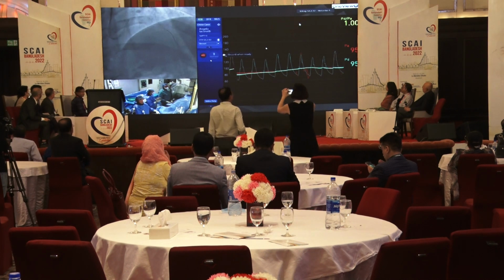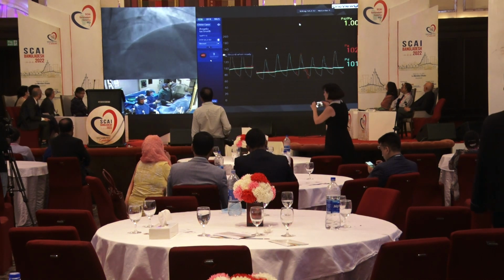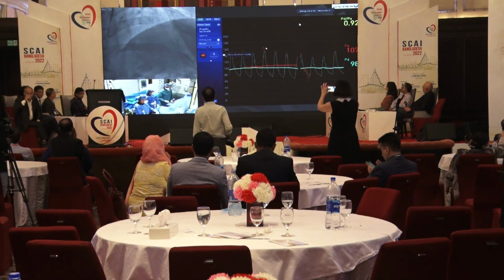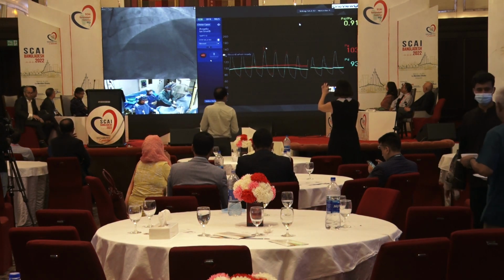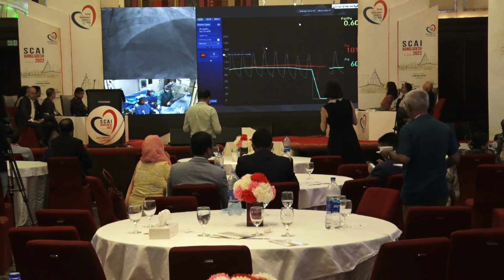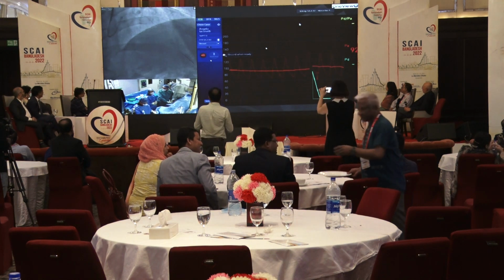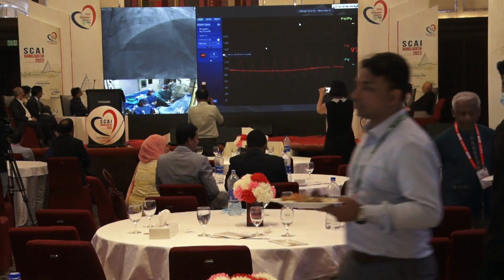Unless you correct the distal disease, you cannot evaluate the proximal. So we're going to place another wire in the diagonal. And then we show you the OCT. We decided to do OCT as imaging strategy.